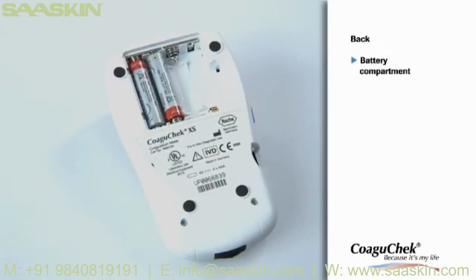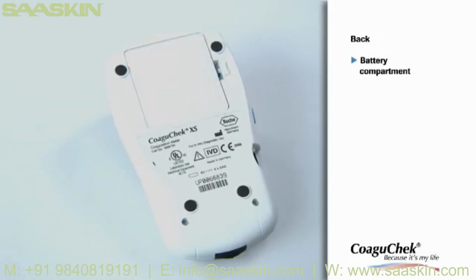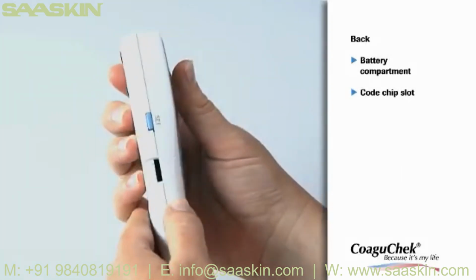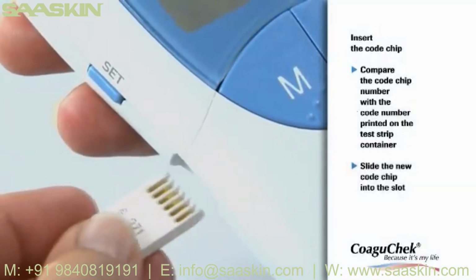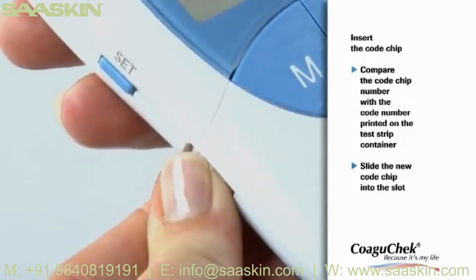At the back of the meter is the battery compartment cover. You can use 4 1.5-volt AAA type batteries. When inserting the batteries, please ensure the meter is turned off. The code chip slot is on the right side. This is where the code chip has to be inserted. Please ensure that the number on the code chip matches the number on the label of the test strip container. Slide the new code chip into the slot on the side of the meter until you feel it snap into place.